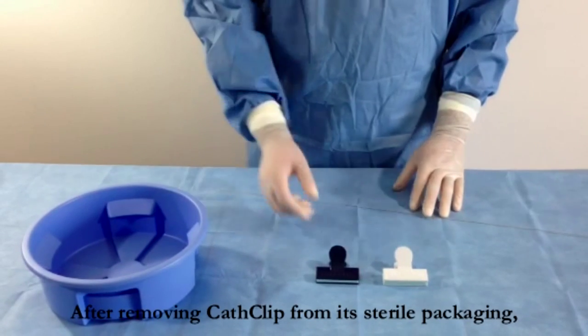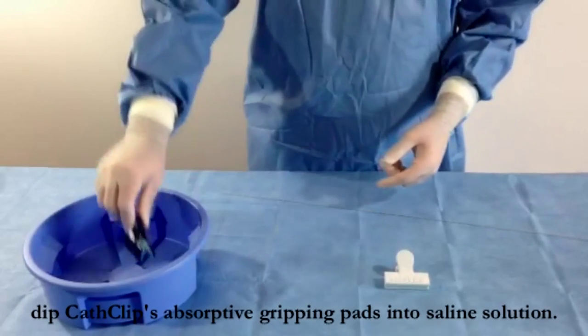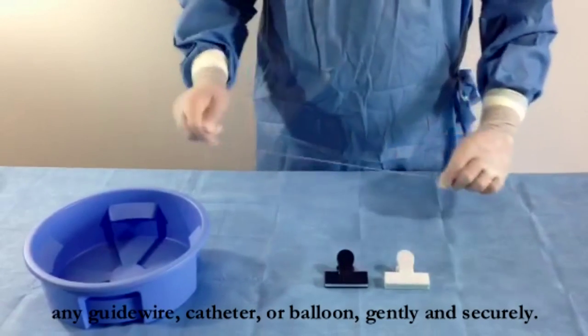After removing CathClip from its sterile packaging, dip CathClip's absorptive gripping pads into saline solution. CathClip is now ready to hold any guide wire, catheter, or balloon gently and securely.